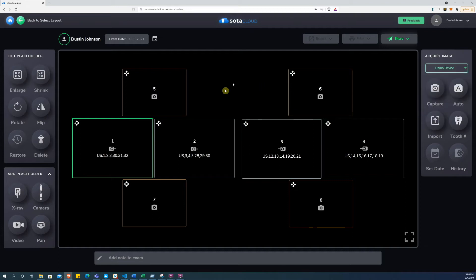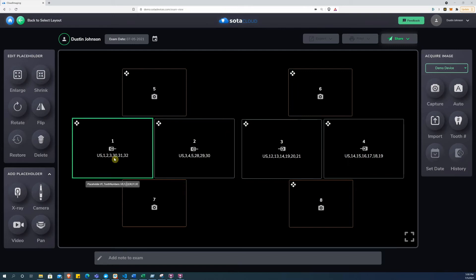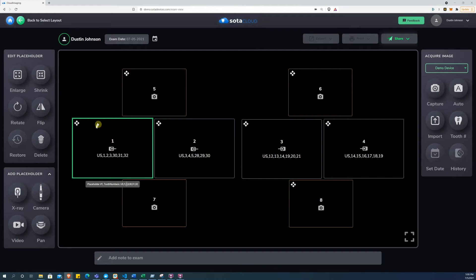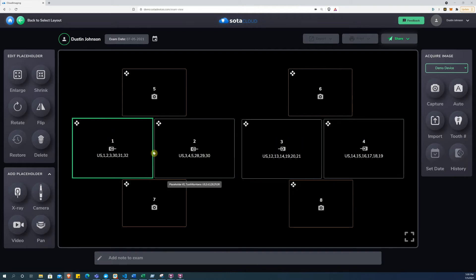Now click on the placeholder that you want to start your exam with. Note that each placeholder contains a tooth number and an order number. The order number on top tells you what order the x-rays or camera images will be captured in. So this will be placeholder 1, 2, 3, 4, and so on.